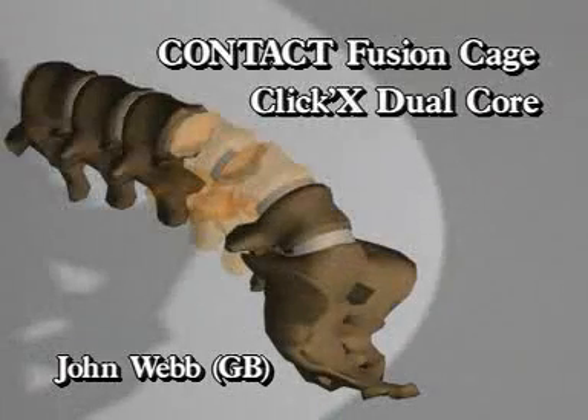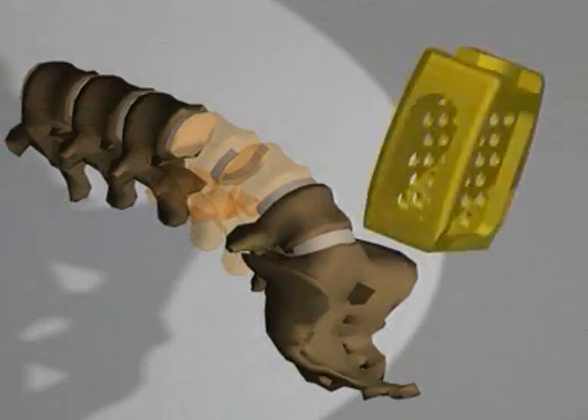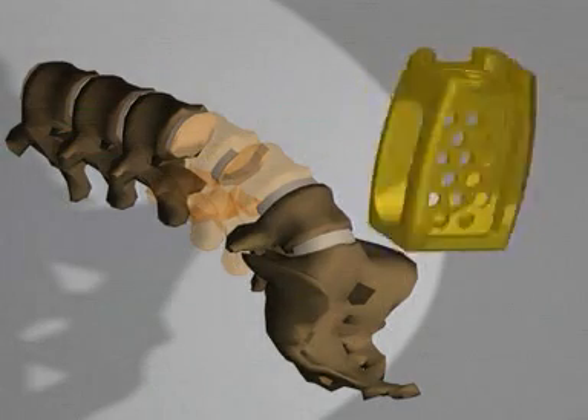The Contact Fusion Cage and Click'X Dual Core. The posterior approach to the intervertebral disc space requires small implants that fit through the small approach channels, thus avoiding problems with nerves and vessels.